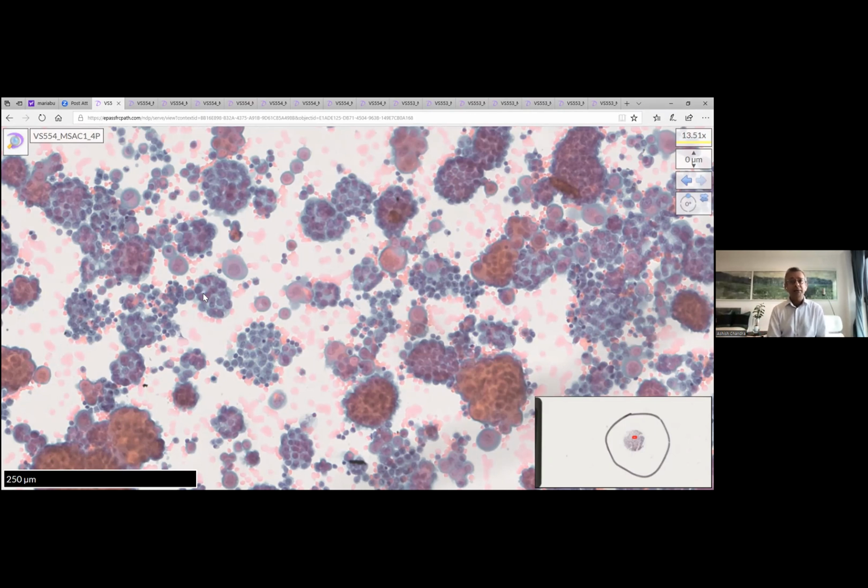If this came in on a Friday evening, and I had to put something out because the patient is unwell, there is no real clear diagnosis at the moment, I would probably put a report out saying it's suspicious for mesothelioma, or it's an atypical mesothelial proliferation. However, there are no features to suggest metastatic adenocarcinoma, and a supplementary report will follow.